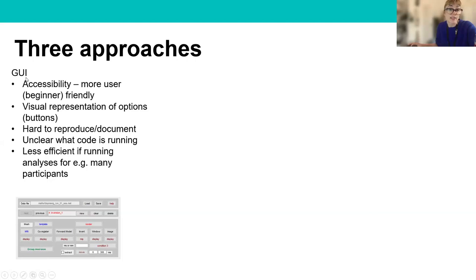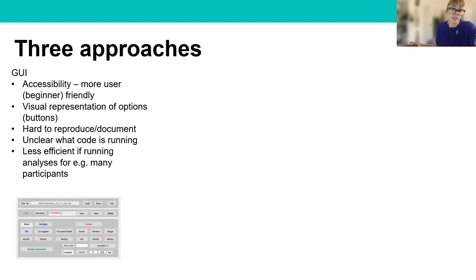The GUI has the advantage that it's very accessible and beginner-friendly, because you can perform the analysis by pressing buttons, giving you a good visual representation of the options. However, with the GUI it's quite difficult to reproduce and document exactly what's been done, because you have to remember exactly which options you've chosen. It's also rather unclear precisely what code is running under the hood, and it's less efficient if you're running analyses for many participants.